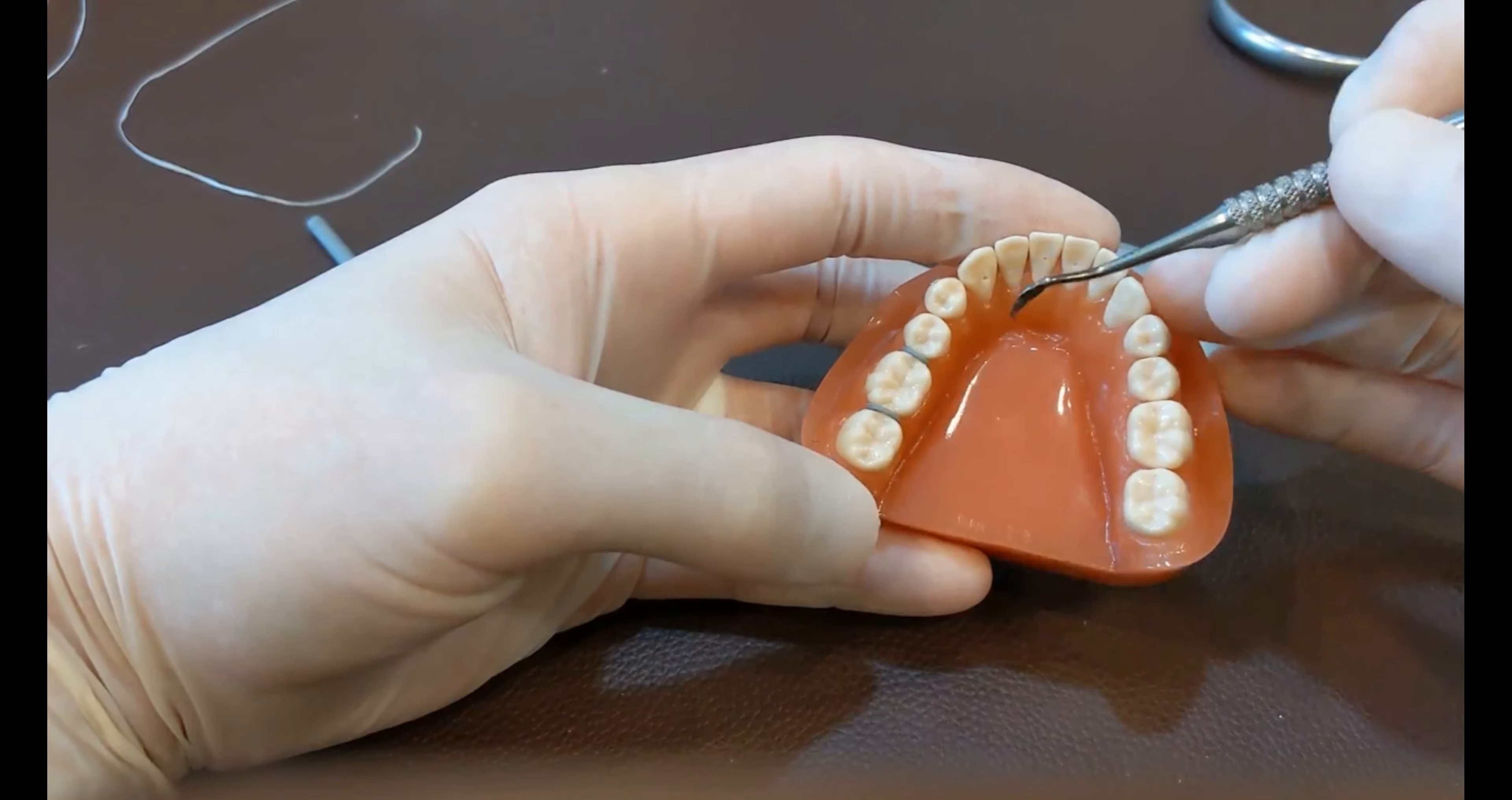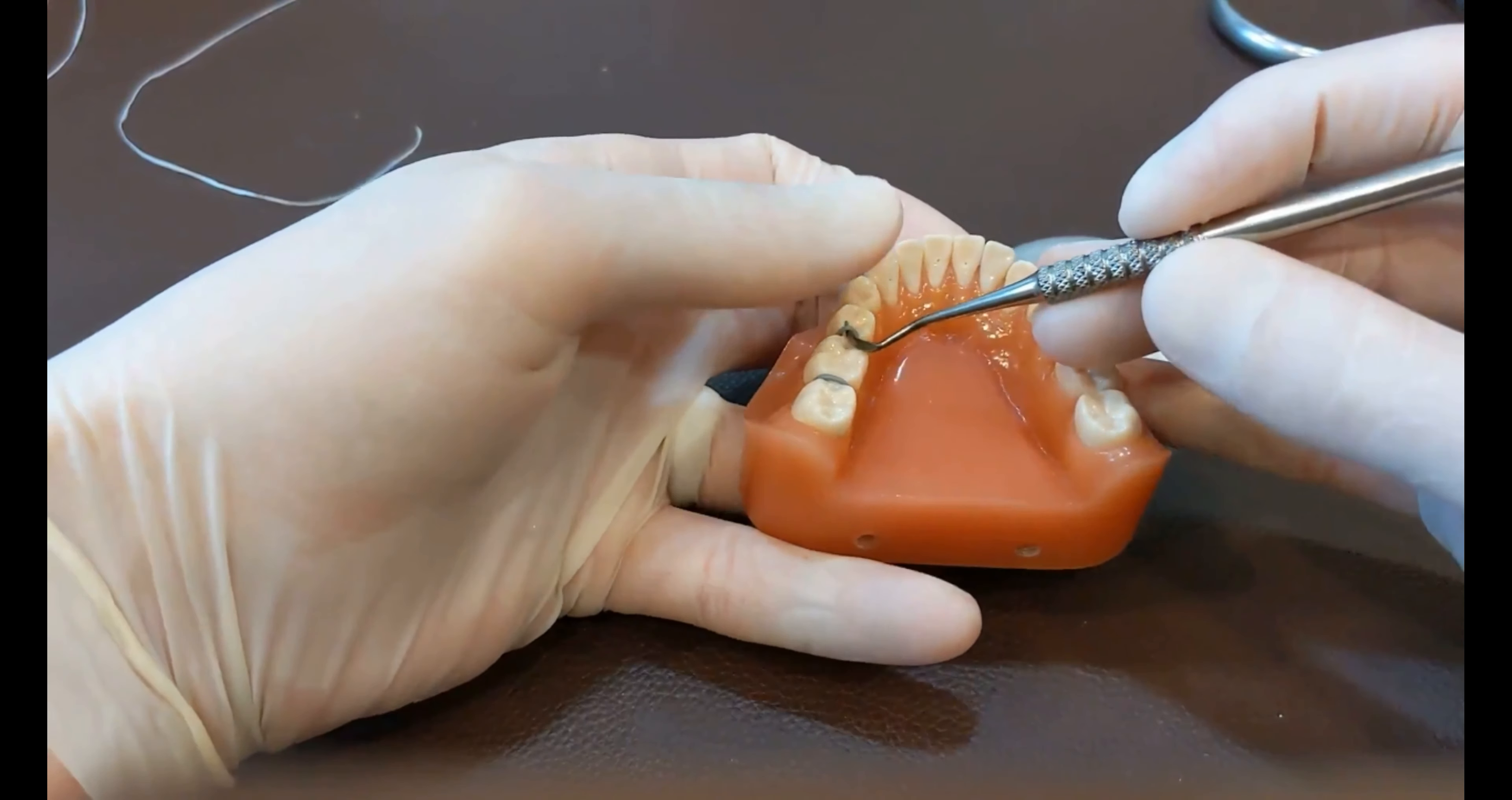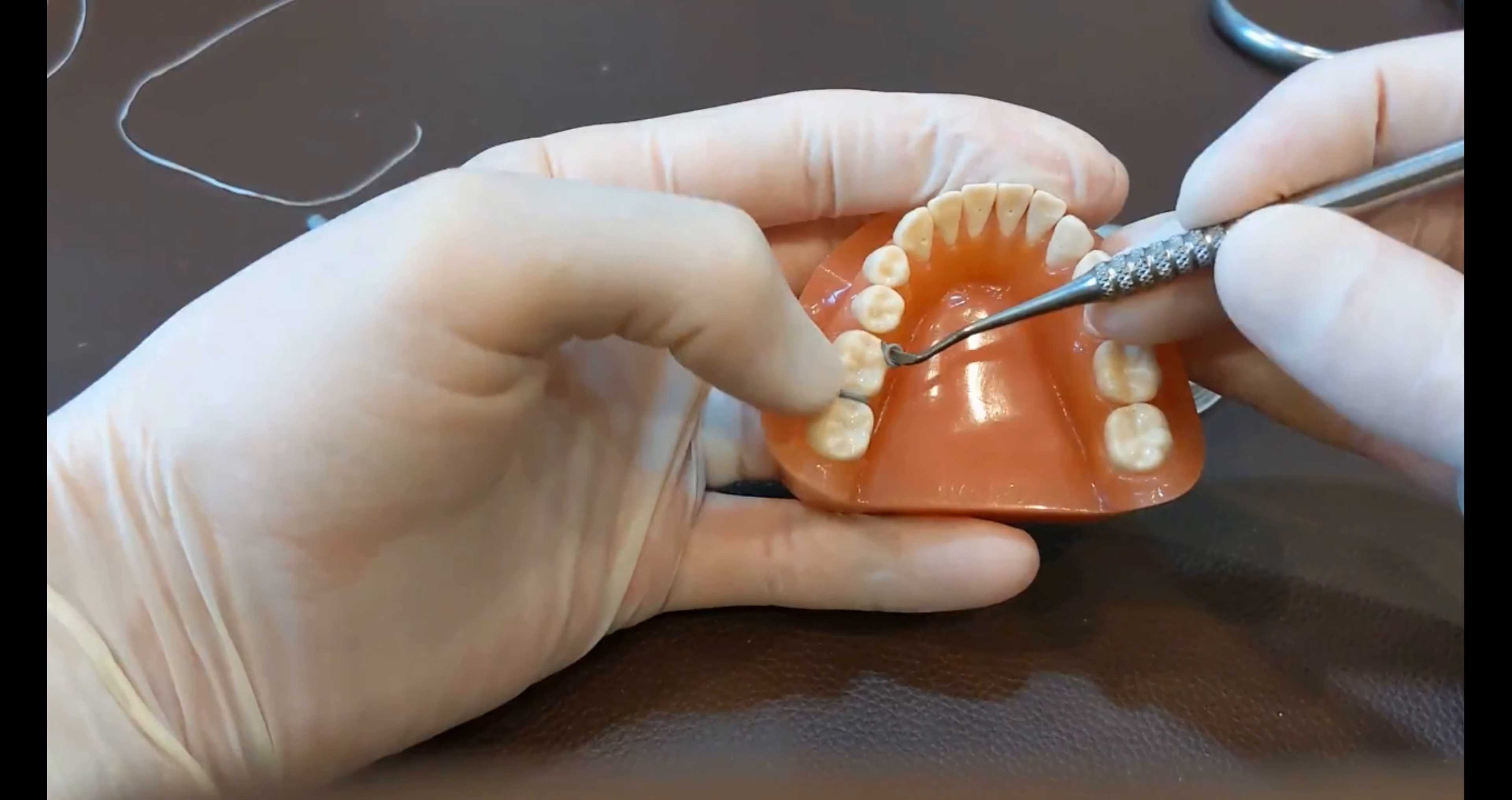To remove a separator, you'll get your explorer in here, and you just kind of wheedle it under there until you get it under the edge, and then you just pull straight up. And I usually put my thumb here so that it doesn't go flying across the room or get lost in their mouth. And then you should see a gap right there where that separator is at, and then you can fit your band on there nice and easy.